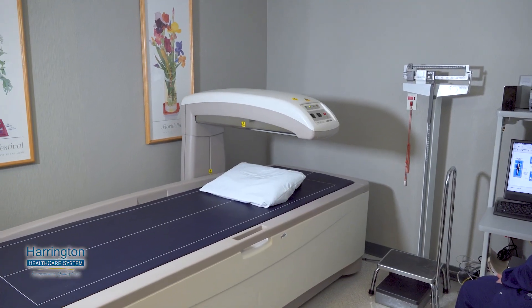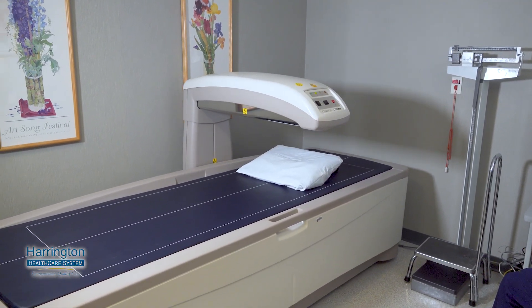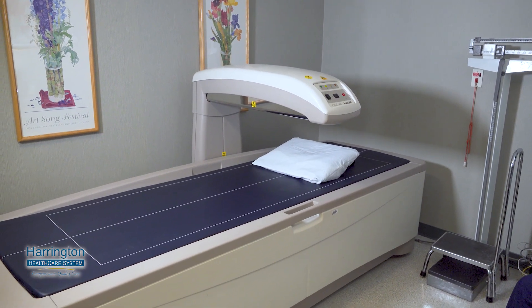There are a number of different reasons that they could do a bone density scan. It could be anything from a strong family history. A lot of times it's women — post-menopausal is a big time to start doing them. It could also be long-term use of steroids or certain chemo medications.